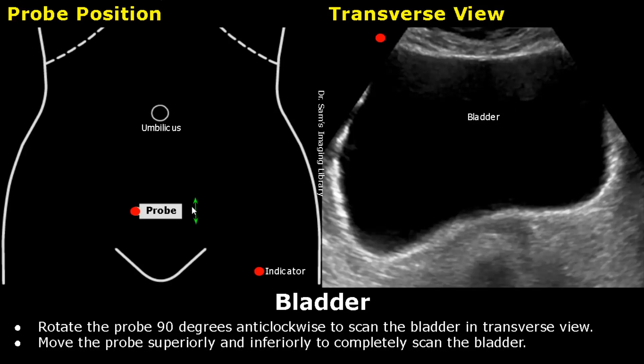Move the probe superiorly and inferiorly to completely scan the bladder. This is how the bladder will look like in transverse view.